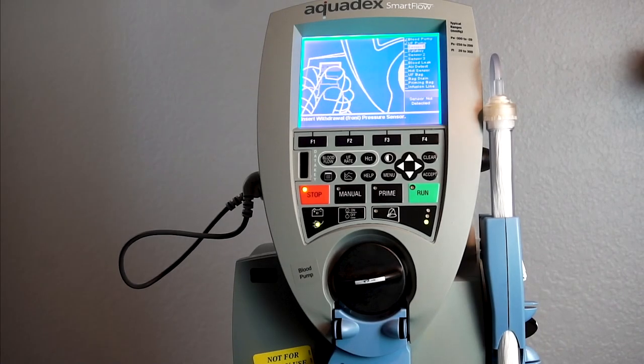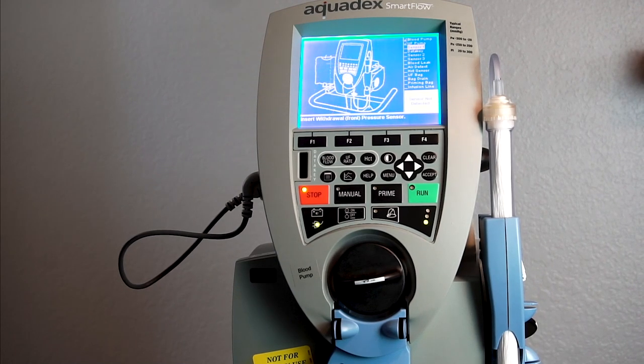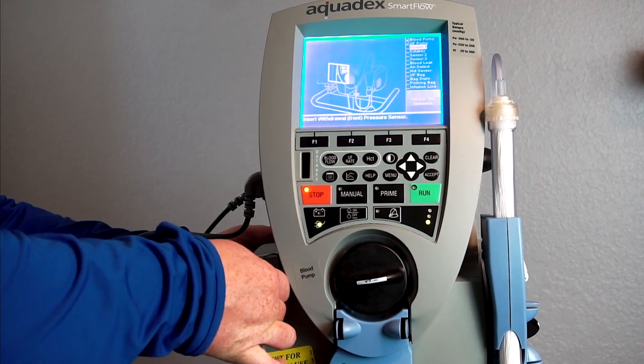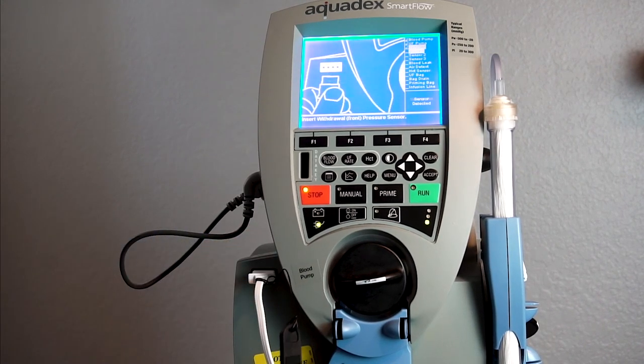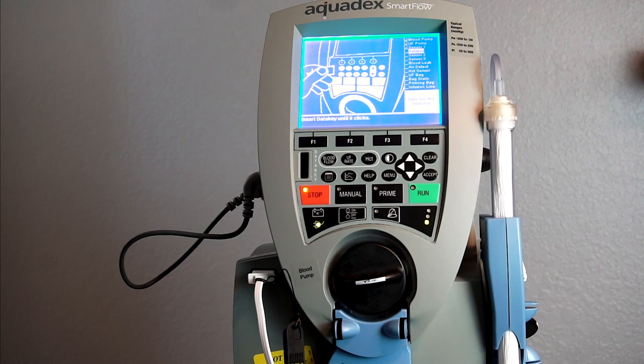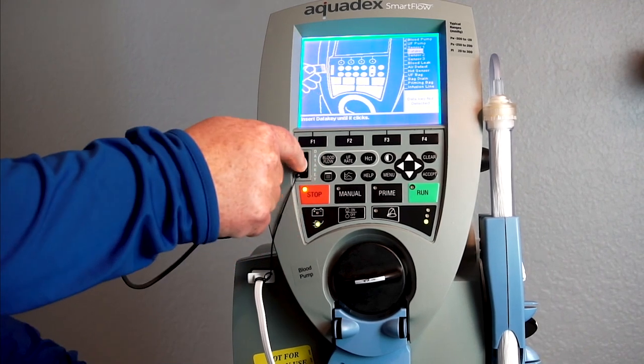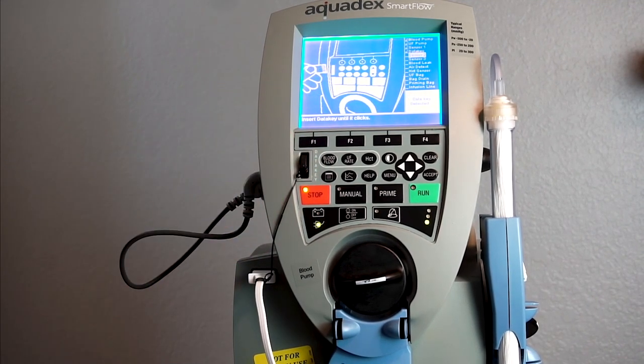Next, you'll insert the first of three pressure sensors — they're all white. First, the withdrawal pressure sensor, which gets inserted into the slot on the front of the console labeled withdrawal pressure sensor. Next, insert the data key until it clicks. This is the key that's attached to the withdrawal pressure sensor.